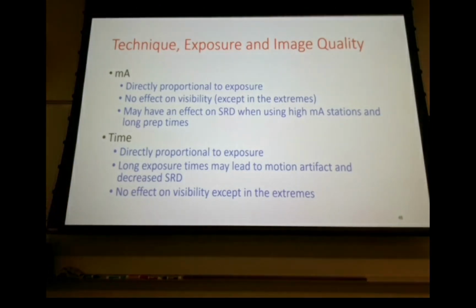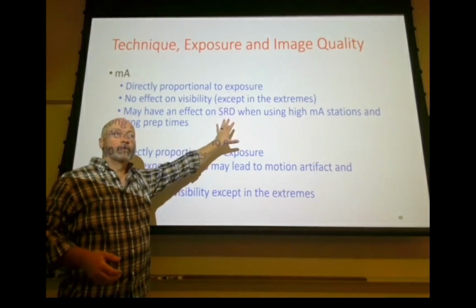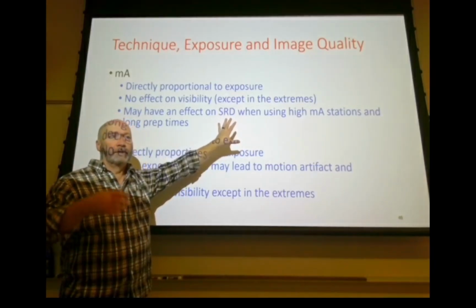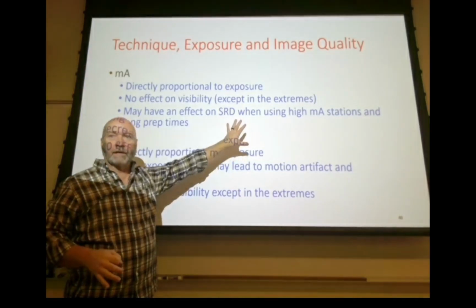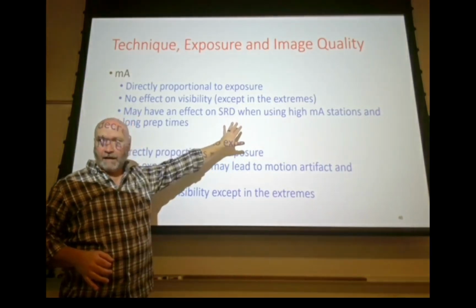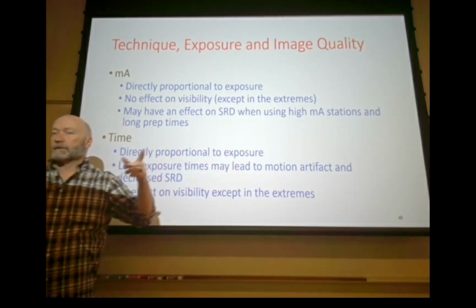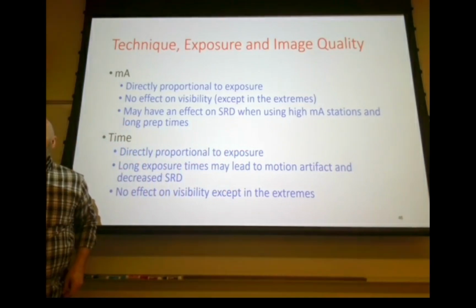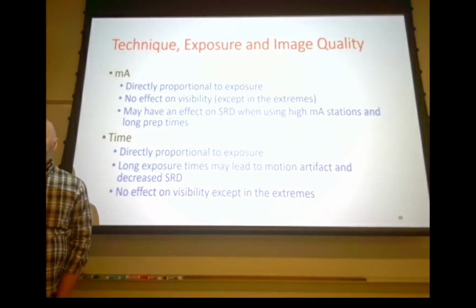So it's kind of an extreme example, but you can see the shadow of my hand really, really well because the light is coming from a very small source, right? So you can see the outline of my hand real well. But the room is lit with fluorescent lights, so you put your hand over your table and what do you see? Nothing. Yeah, you see an ugly shadow, right?